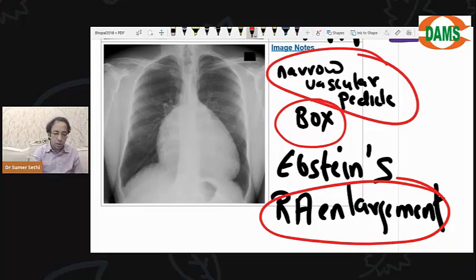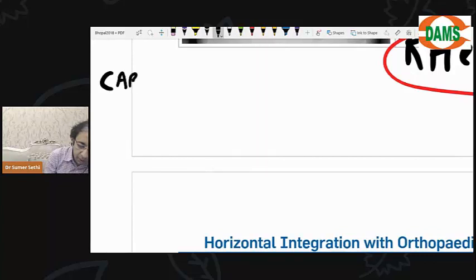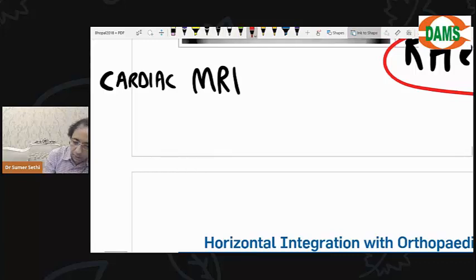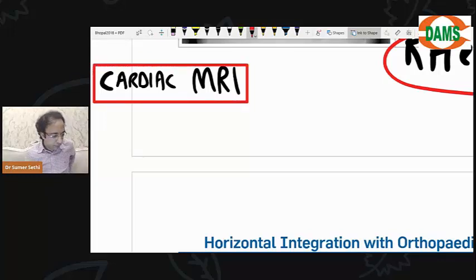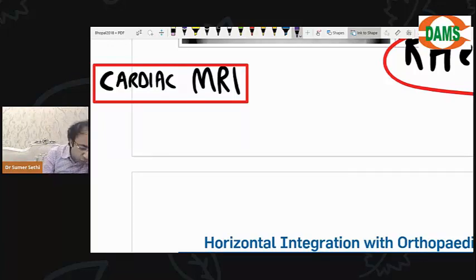Okay, very good. So once you're able to answer this, quickly before going on to the next topic, just tell me, is there any role of cardiac MRI today? Okay, we saw the cardiac CT in the beginning of my classes, but is it possible to do a cardiac MR? Is it possible? Okay, I'm going very slow, beta. Is it possible to do a cardiac MR? Answer is yes. Why would you do cardiac MRI? Remember the magic word here.